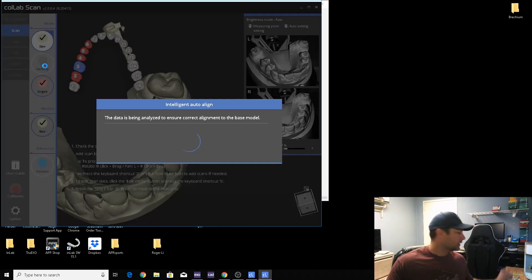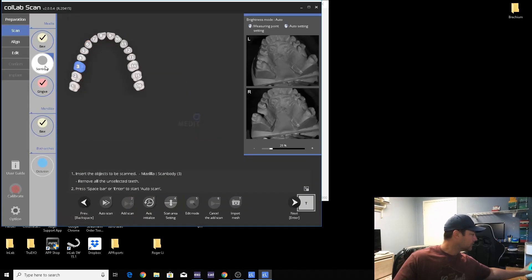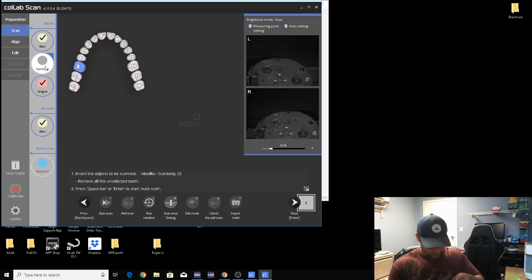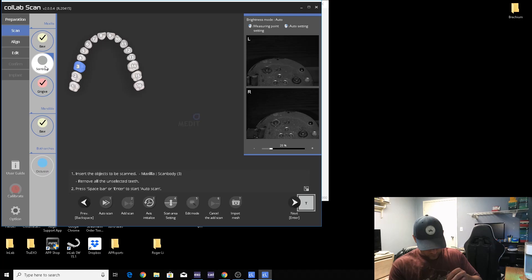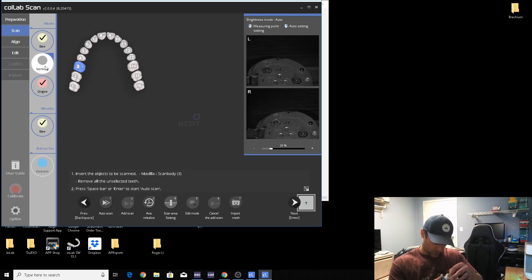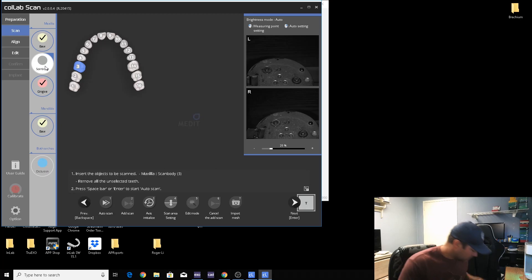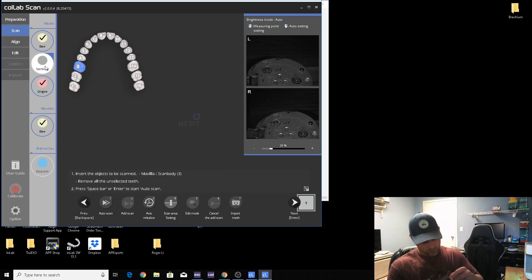Okay, and now we will scan the scan body. And the driver is the driver. I'll screw this down and make sure it's seated properly.